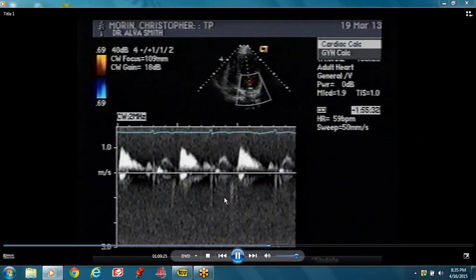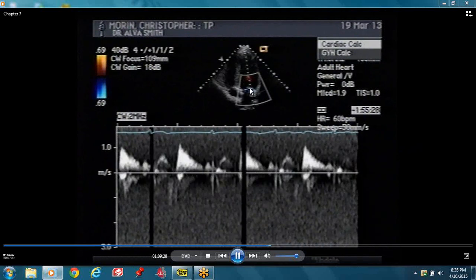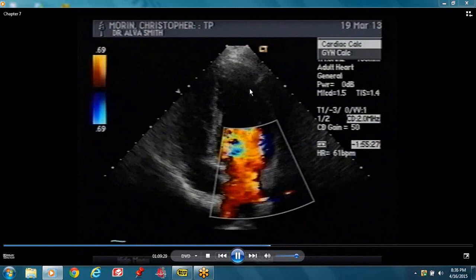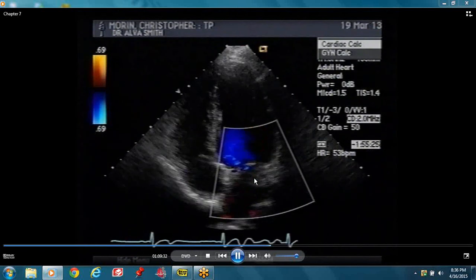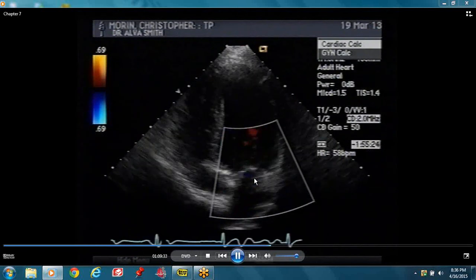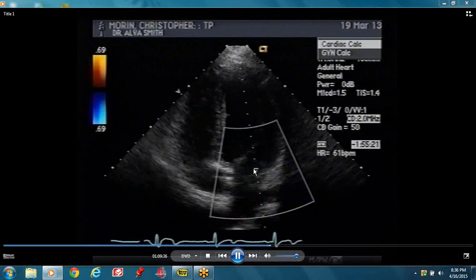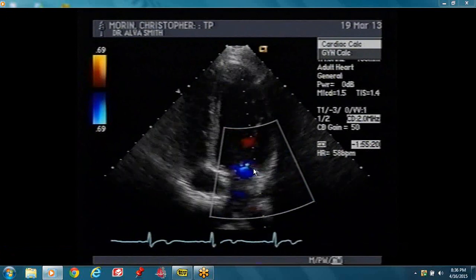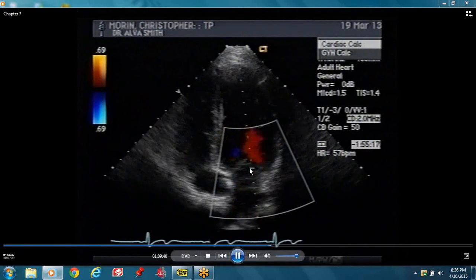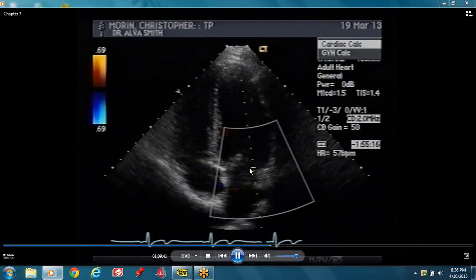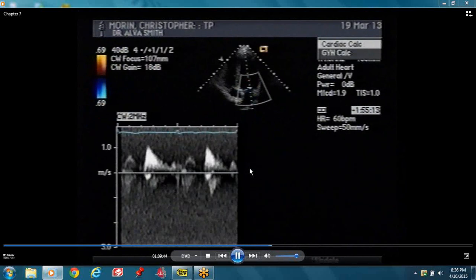We are a little lower than the tip of the leaflets. This is a normal study so there's no significant regurgitation — you see little specs which is physiologic regurgitation.